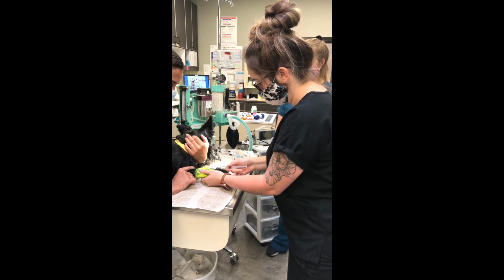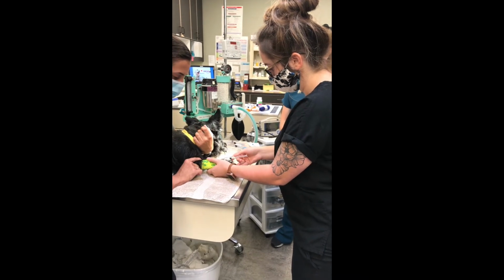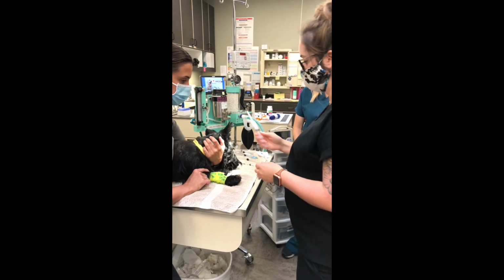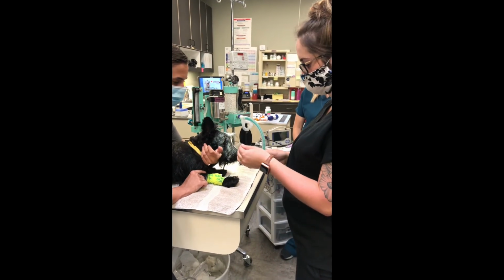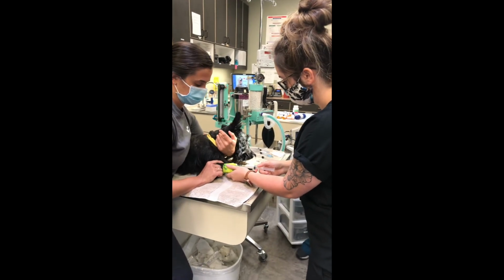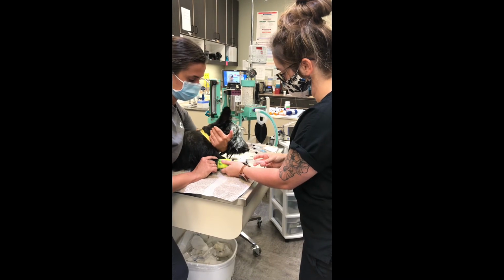Flush that through. And then propofol to effect, this slowly.